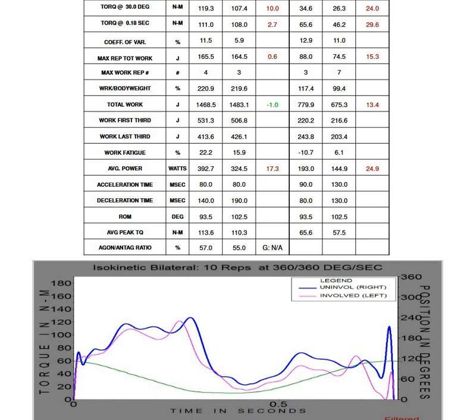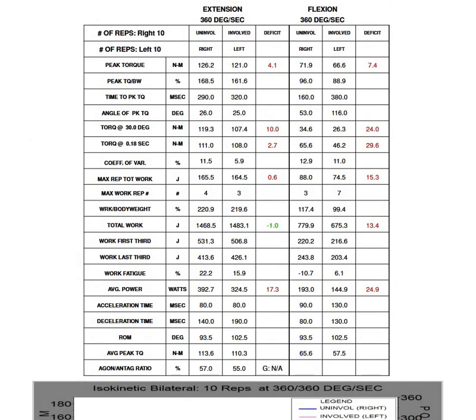And finally then acceleration and deceleration time, which are just above range of motion there. Doesn't mean they don't have their value. Everything on an isokinetic report can be interpreted in one way, shape or form, but these are the three that I would place least emphasis on, arguably, in your written report. So let's start with range of motion. This is fairly obvious. This is determined when you're setting the test up, so you dictate what the range of motion is.